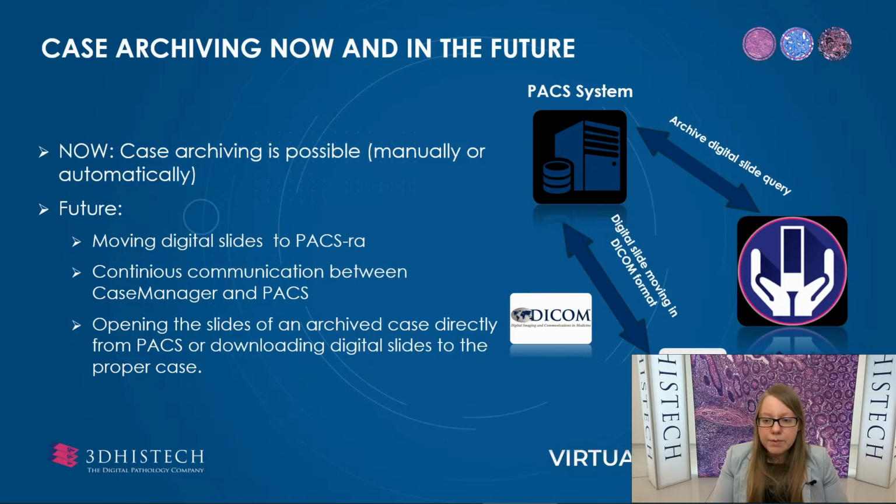During the case archive process, the slides are moved from the Case Manager's slide storage to the PACS system. With the help of the continuous communication between Case Manager and PACS system, the slides of an archived case can be opened directly from the PACS, or they can be downloaded to the proper case. For moving the digital slides to PACS system, it is necessary to provide an automatic DICOM conversion. During the conversion, the patient data from Case Manager is introduced to the slides.